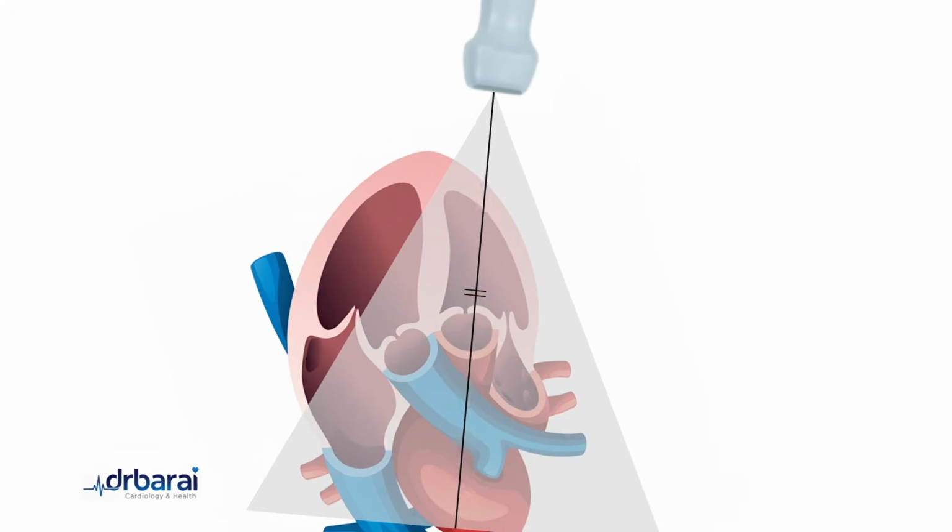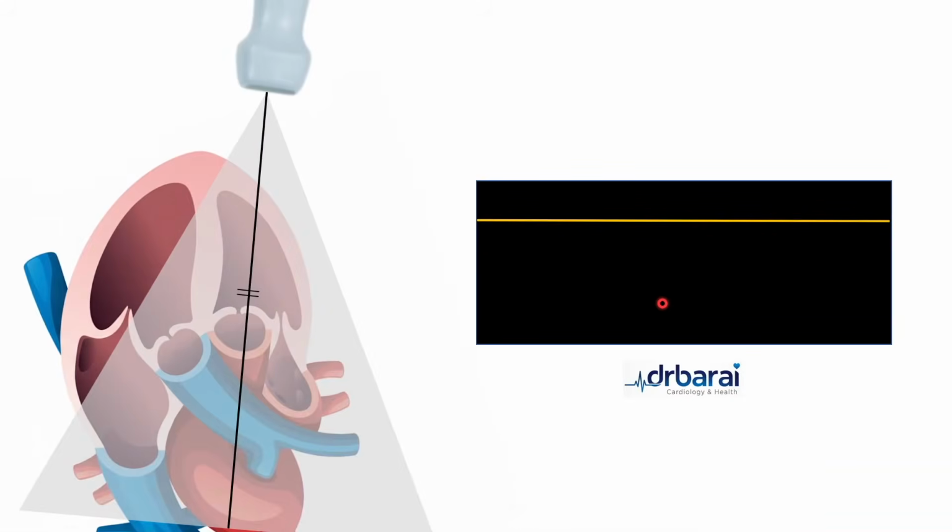And once we press on the buttons to identify if we can get the LVOT VTI, it will look like this. So every time there is blood flowing through the aortic valve or left ventricular outflow tract, we will get this type of waves. What it necessarily means is that the blood is going away from the probe. That is why it is negative, it is going down.